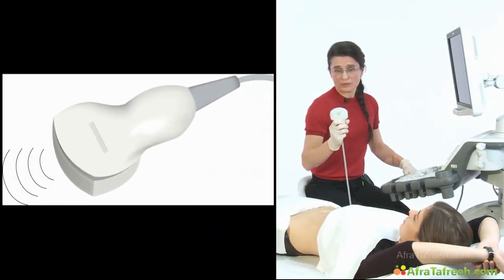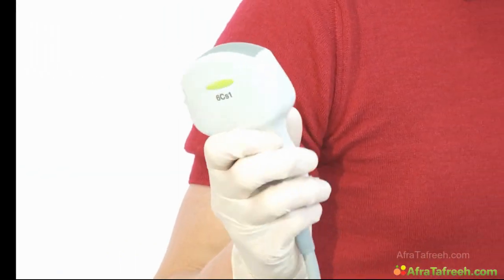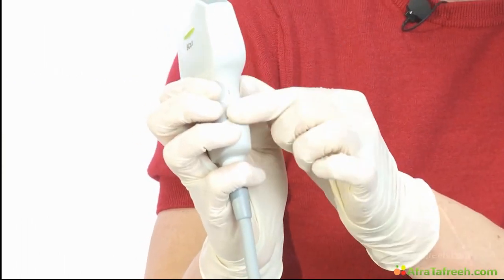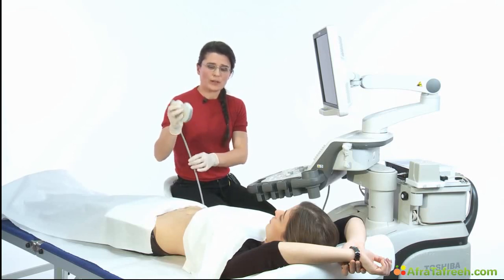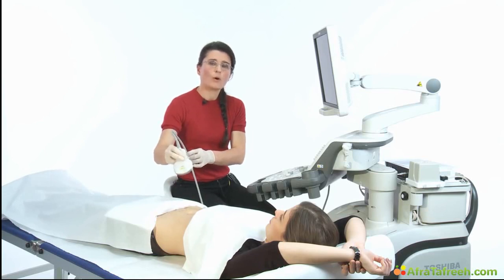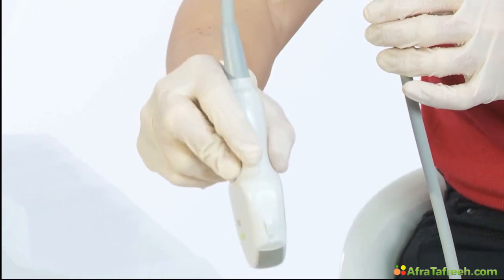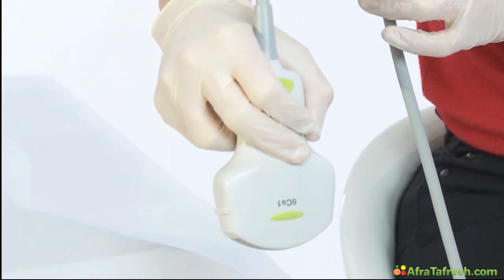This is a curved array transducer, which is normally used for abdominal ultrasound, and it's got a range between 3 and 6 megahertz. As you see, we got a mark here, a vertical mark, over here and over here. And this is important to know because this is our orientation. The mark is either to point to the head of the patient or to my side, meaning the right side of the patient. So again, the mark either pointing to the head of the patient or to me, to the right side of the patient.